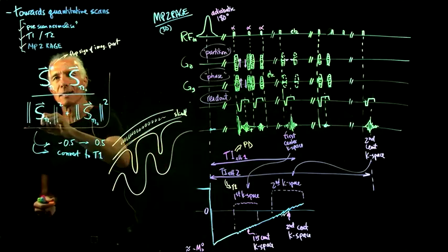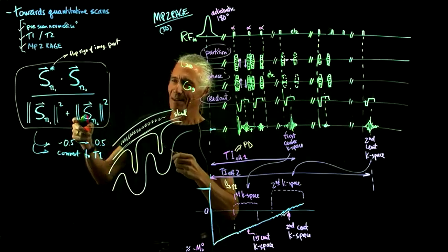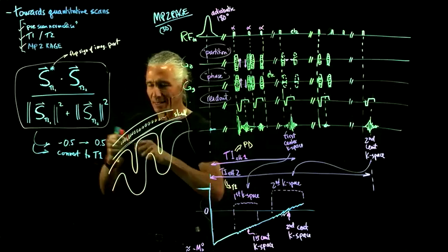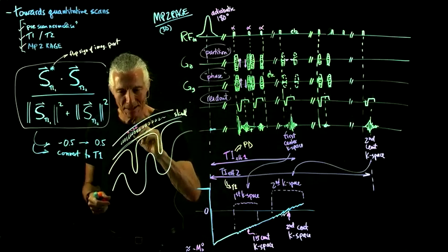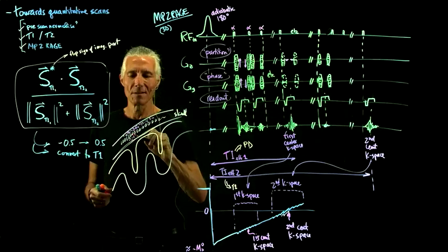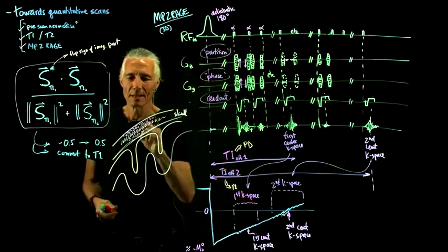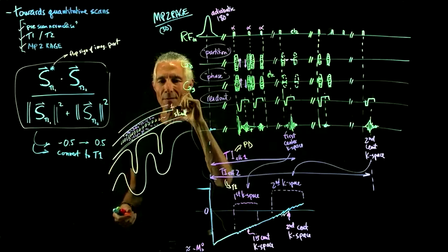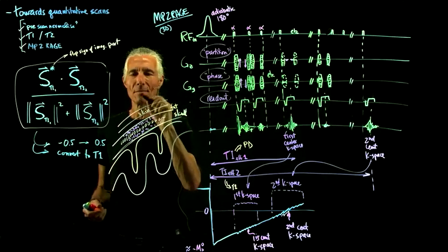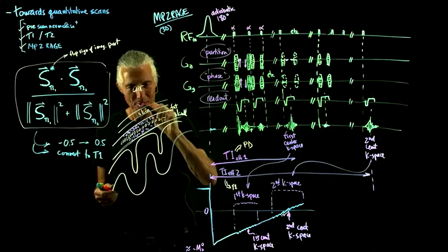When we do this calculation, we divide a small noisy number by itself, and what do we get? We get a bunch of junk. When you process this image, you'll see a complete speckled black and white noise in here. It's not black anymore. And then we get out to the little fat layer. That one's got a signal again, and then we get out to the skin. But when we get out to the air, complete mess. It's just speckled black and white.